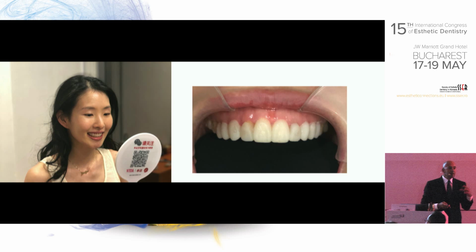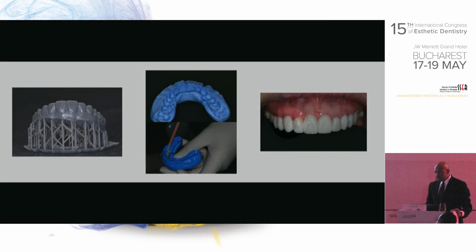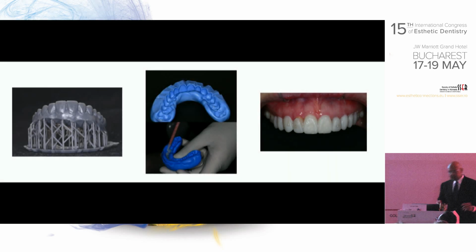Now I'll tell you one other very sophisticated part of this program when I back it up. Look at this. Do you see these dots here? These are the points that you use for Invisalign. So normally, if I would make the lab prepare a wax up for them to come over here, either they would need to cut them off, or I would need to cut them off to seat the tray.